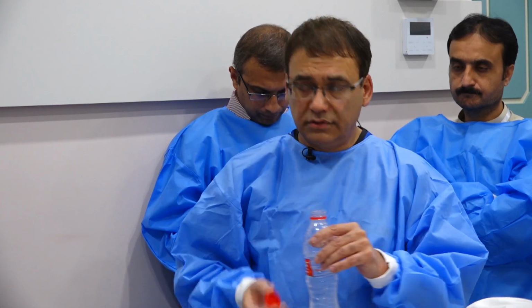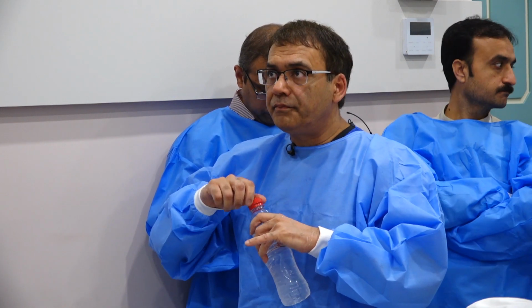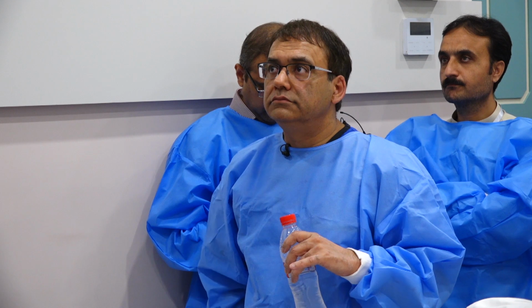Thank you, Dr. Hassan. One last one. What on EUS would make you feel like there is a stricture in the bile duct in a patient that already has a stent, assuming that you don't have as much air artifact in there? What features morphologically would you look for that would tell you that this is a stricture?